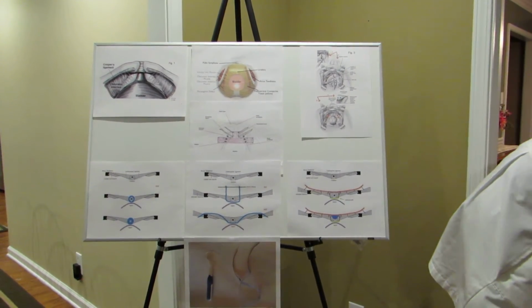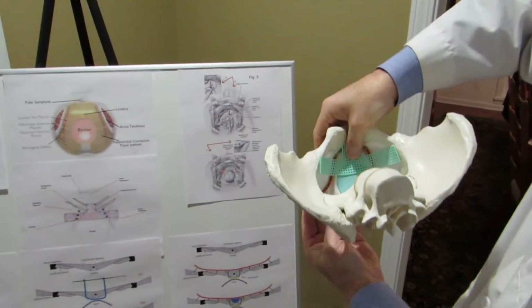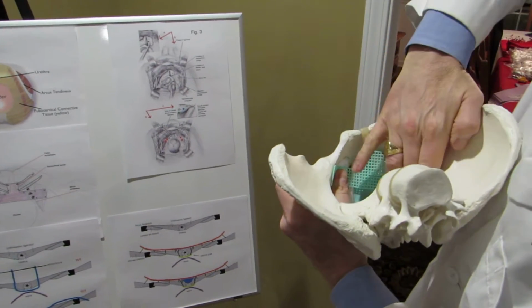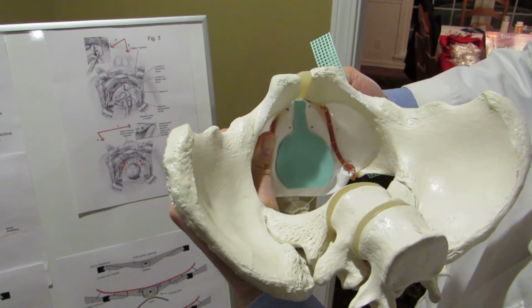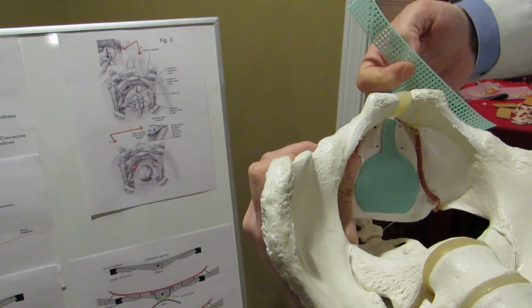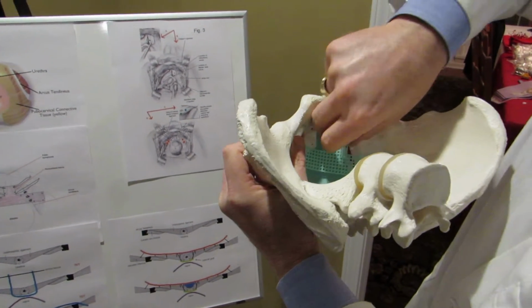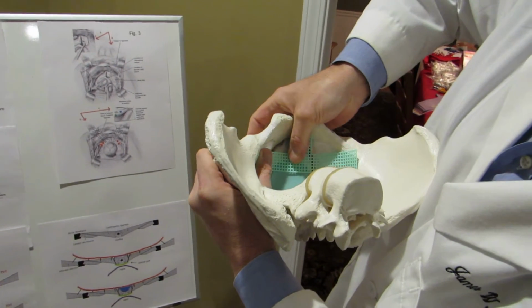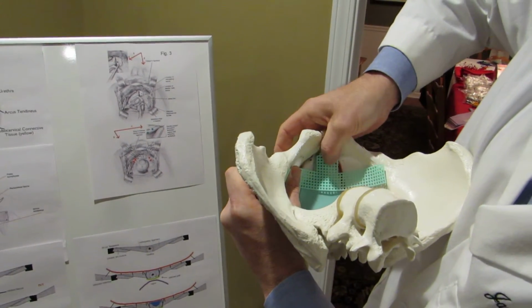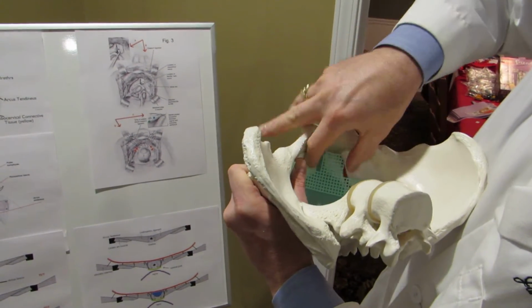In the pelvis here that we have, this would lay in here as such, like this. The surgeon has several options. You can basically repair any of these lateral defects first, or you can basically reduce it, and while it's reduced with a finger or some other agent within the vagina, you can lay this on there and tack it down with fine instruments or deploying devices with a robot and lay this in the pelvis as such. Once the surgeon has all this reduced, keeping this a fixed plane, they can then work on the expandable member, which is underneath the implant but on top of the urethra, in order to expand posteriorly.